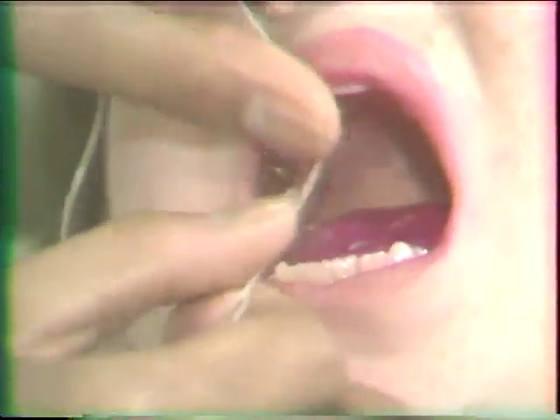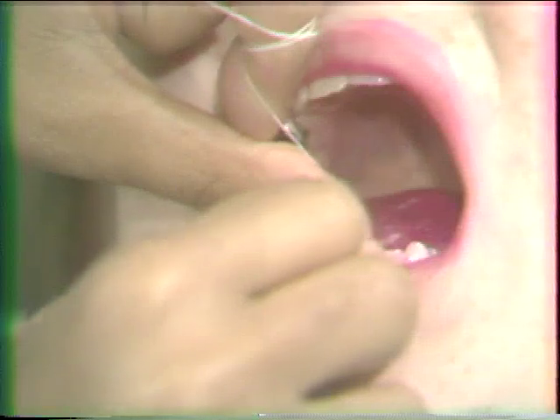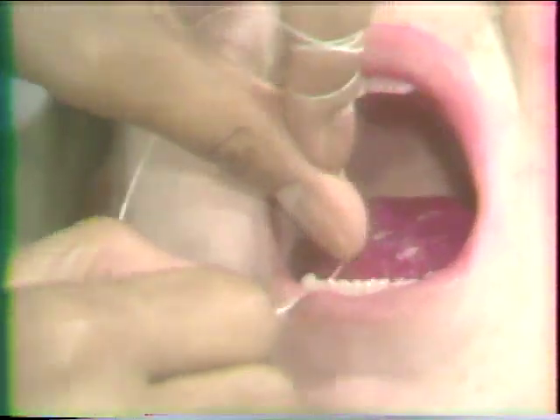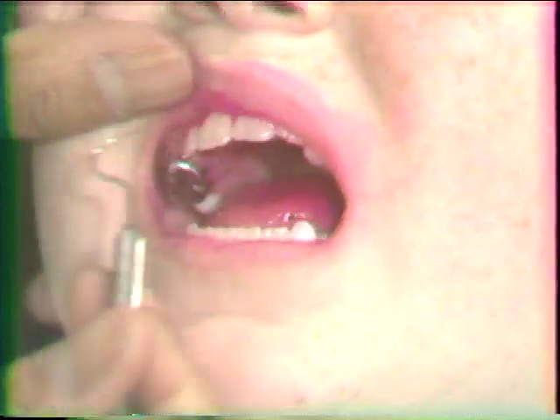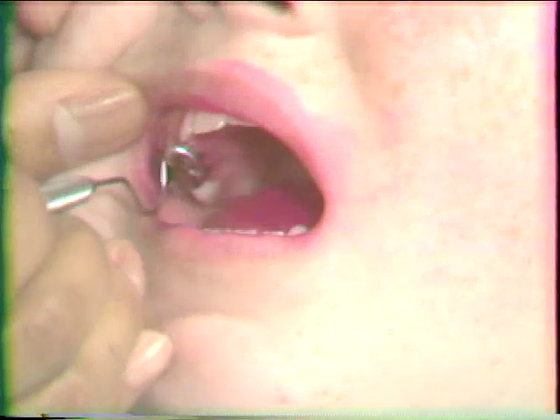When all the surfaces have been polished and before rinsing the mouth, use dental floss to pull prophy paste into the interproximal surfaces. It is recommended that the remaining disclosing wafer now be used to check for any areas omitted during the prophylaxis. The patient is now ready for the fluoride treatment.